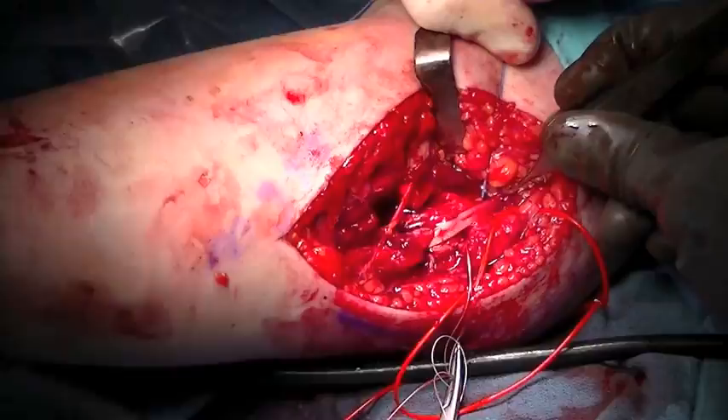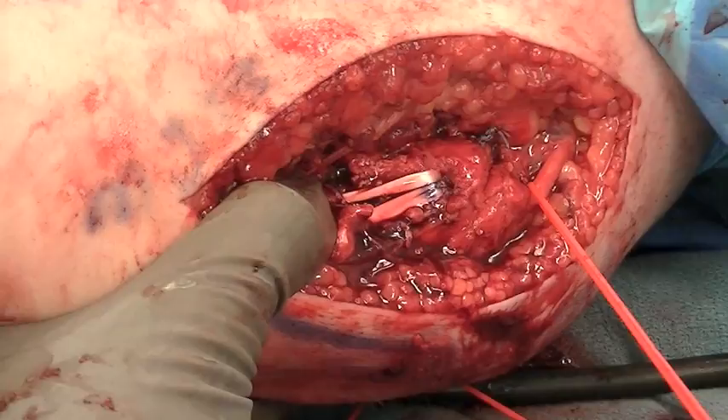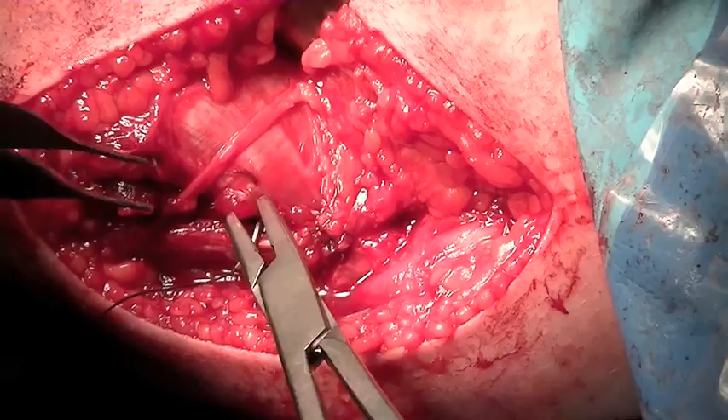The graft has now been already passed through the sublime tubercle. Sutures are placed into the two proximal tails, which will then both be tunneled into the distal humerus. The sutures are tied onto themselves and then ultimately reinforced with a biotenodesis screw as shown here. The sutures can also be used to reinforce the graft to the native residual tendon.